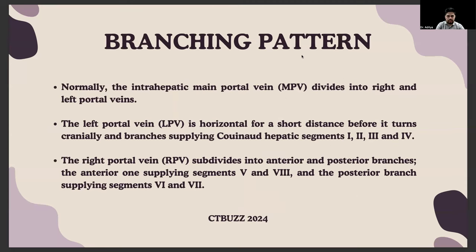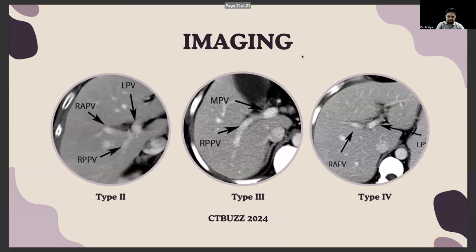Regarding the normal branching pattern: the intrahepatic portal vein — the main portal vein — divides into right and left portal branches. The left portal vein is horizontal for a short distance before it turns cranially, supplying Couinaud segments 1, 2, 3, and 4. The right portal vein subdivides into anterior and posterior branches; the anterior one supplies segments 5 and 8, and the posterior one supplies segments 6 and 7. This imaging illustrates the same in pictorial format.